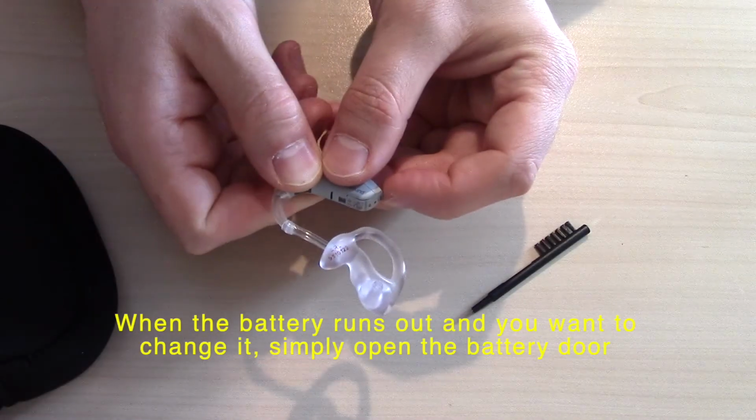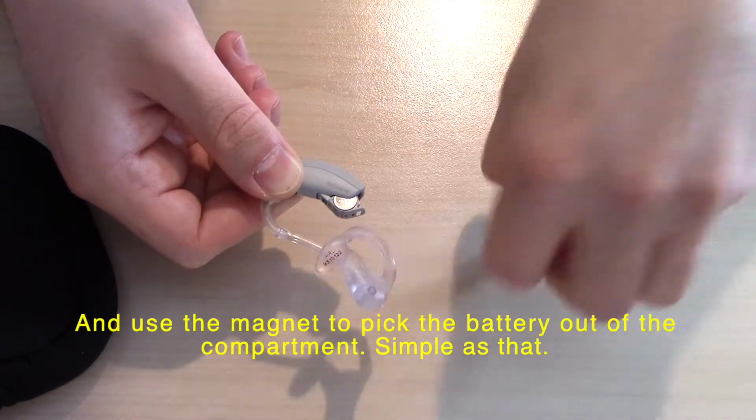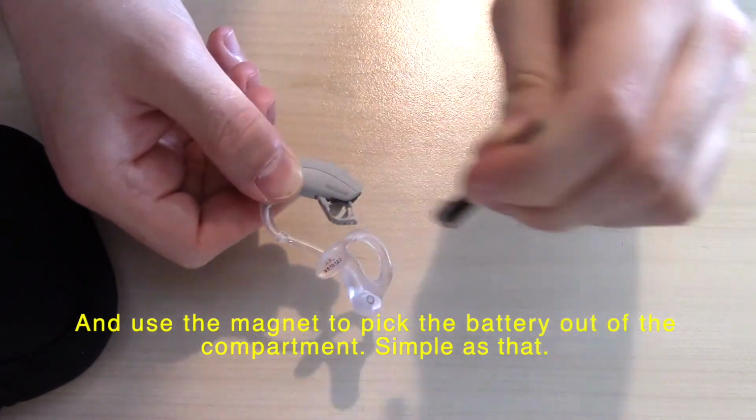When the battery runs out and you want to change it, simply open the battery door and use the magnet to pick the battery out of the compartment. Simple as that.